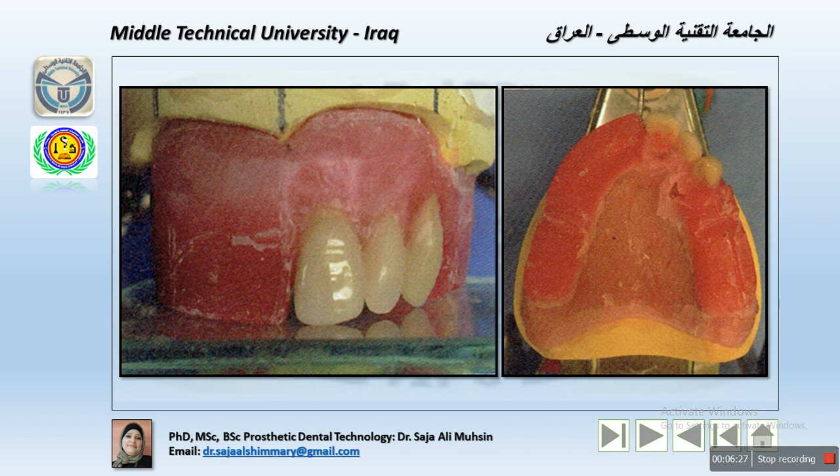It has been recommended to use one side and then the other because sometimes we have an asymmetrical arch. Focusing on the two centrals, then the laterals and canines, gives us a false setting in terms of the buccolingual width where we have to position the teeth, and also in terms of the alignment of the long axis of the teeth over the alveolar ridge.